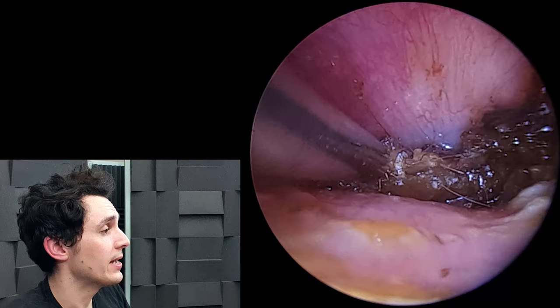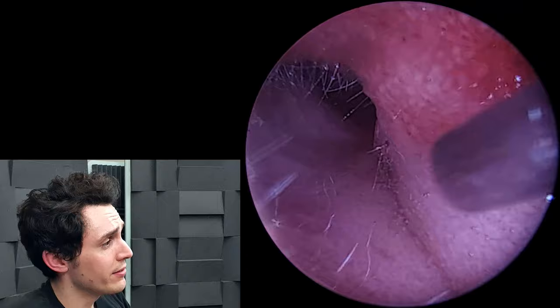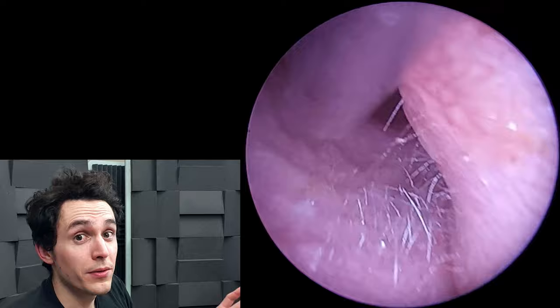Trying from a different angle here, but I'm really not going to get purchase on this. You can see there is oil down there — you can see it glistening.